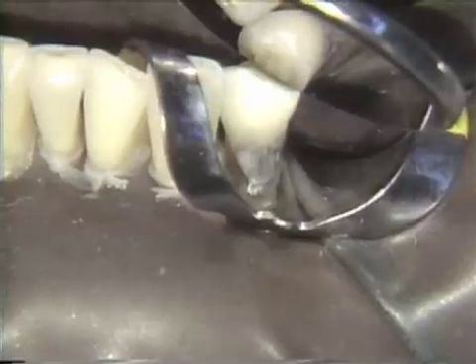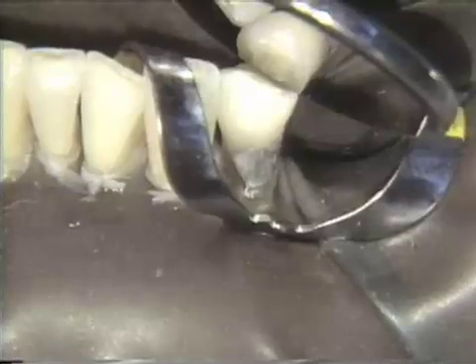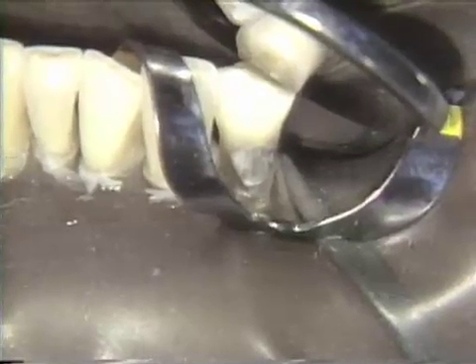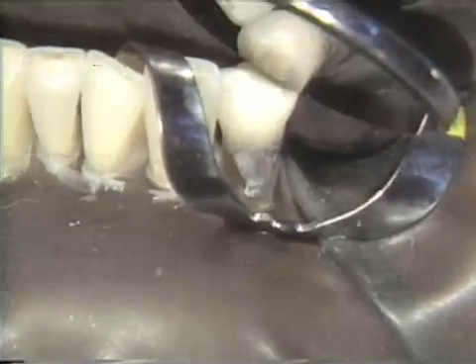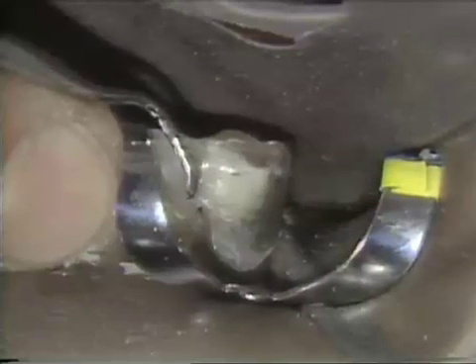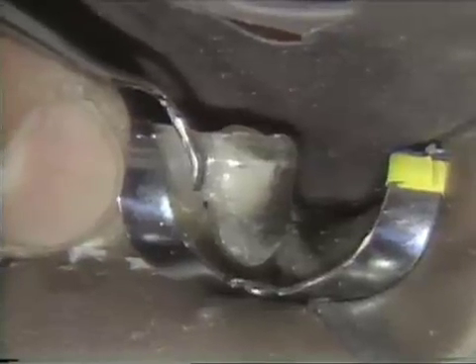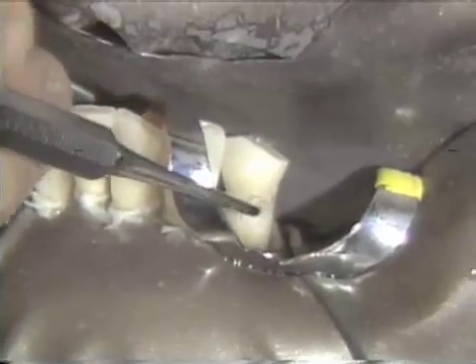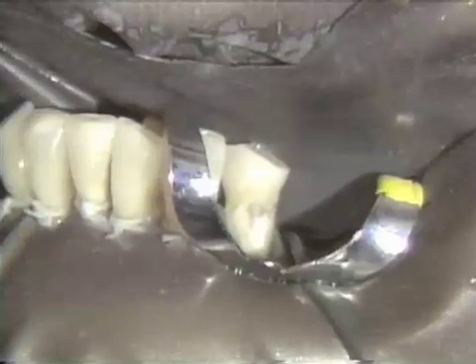The teeth have been scaled and polished and the composite color has been selected. For the most predictable result and optimum adhesion, a rubber dam is an essential part of this technique. A cervical clamp has been placed to gain access to the deep margin of the existing leaking amalgam restoration on tooth number 21. The vacuum-formed matrix is tried in the mouth and tested for accuracy to ensure that it fully seats with the rubber dam in place. After the amalgam and recurrent caries are removed, glass ionomer liner is placed and the enamel is beveled at the incisal.